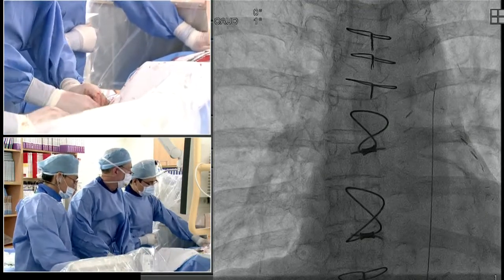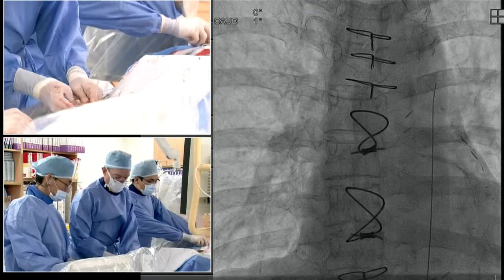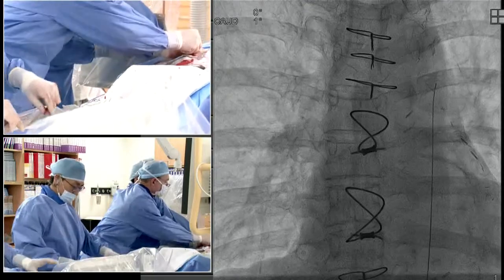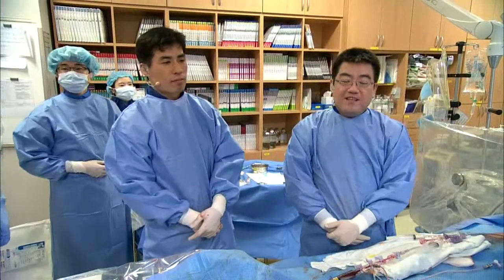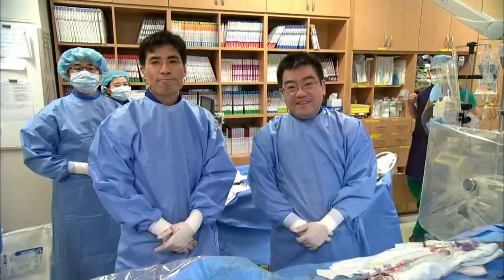Okay, Dr. Burket, Dr. Gao is waiting for us next door. So wonderful. We can come back after finishing your procedure. Wonderful, thank you. Okay, thank you. Great case. Okay, Dr. Gao. Yes, good morning, I'm Dr. Hsien. Professor Hsien, good morning. Okay, thank you so much for waiting for us for a long time. No problem, no problem. Yeah, we are okay, chatting please, here. Introduce the case and your team together, okay. Yeah, today I'm working with my old friend, Professor Rhee here. So I'll let him introduce the case for you.